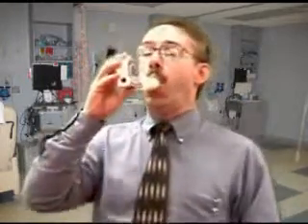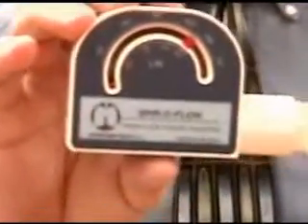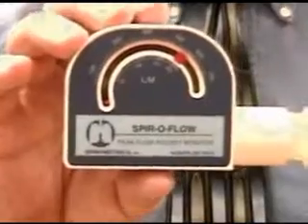What you want is a big breath in and an open-mouth exhalation through the peak flow meter — like this. Big breath in. When you do that, the amount the patient exhales will be the peak flow for that patient.